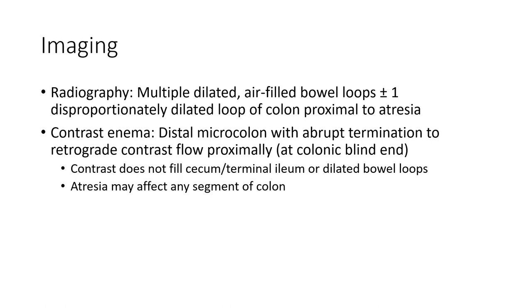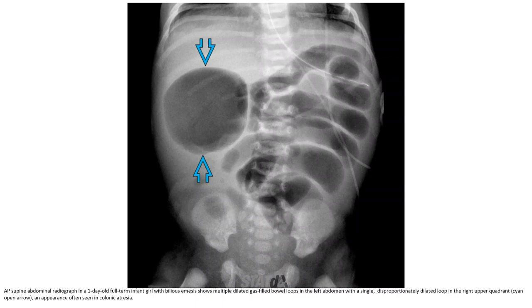The atresia may affect any segment of the colon. On supine abdominal radiograph in a one-day-old full-term infant, there are dilated bowel loops in the left abdomen with a single disproportionately dilated loop in the right upper quadrant, an appearance often seen in colonic atresia.